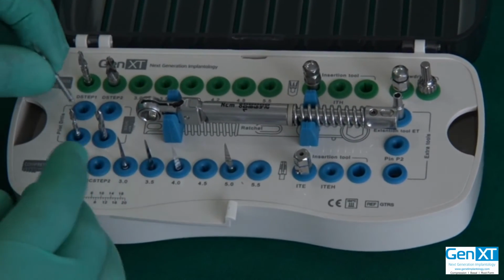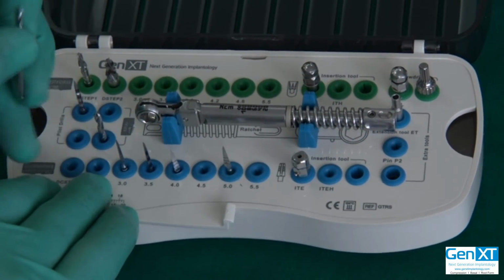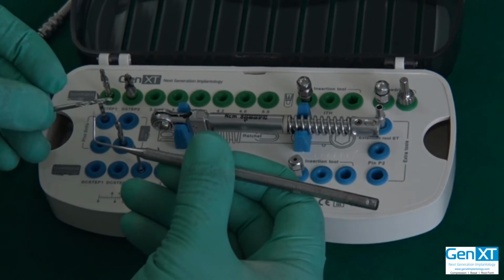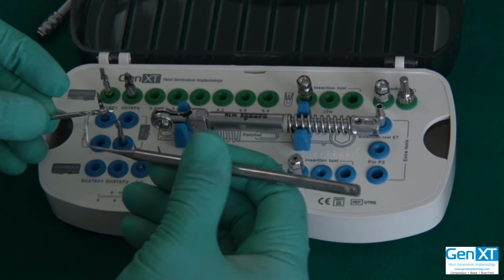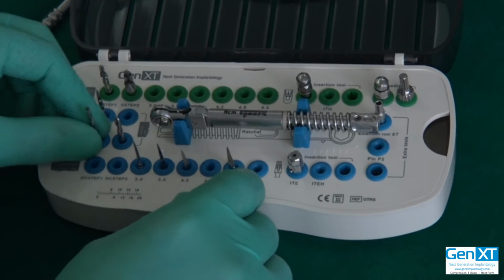Once you go ahead with that, you need to put your 2 millimeter pilot drill also up to the desired depth. There are cuts in this drill. These cuts are very helpful when you take a radiograph with this drill. You can see the measurement in the X-ray as well. So this is also marked from 8 millimeters to 16 millimeters.